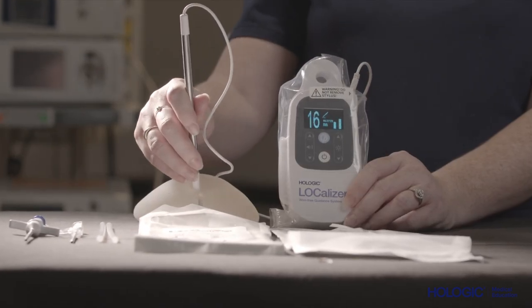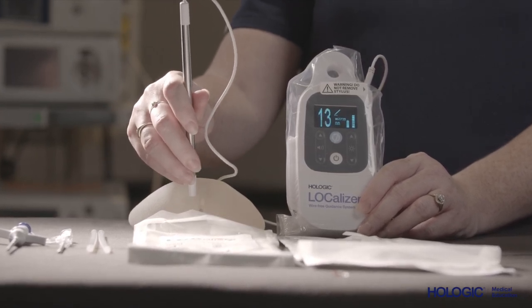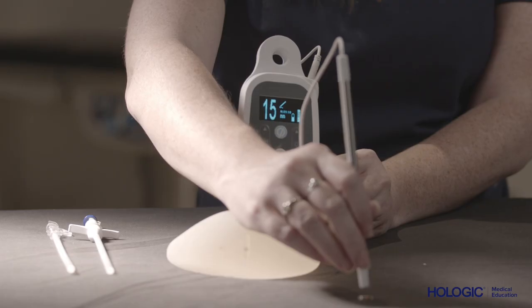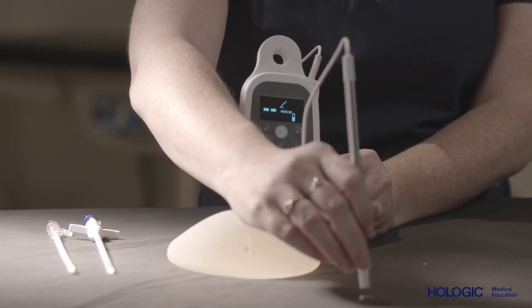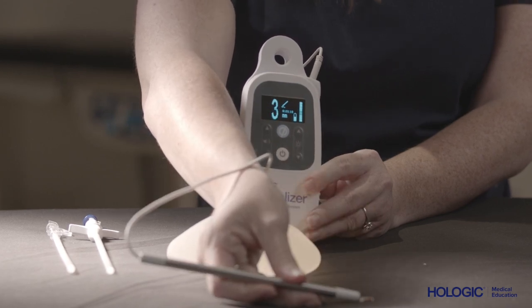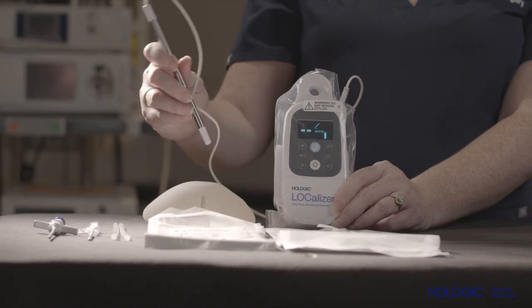The second probe is a surgical pencil probe, which guides the surgeon to the target tissue during the procedure while dissecting down into the tissue. With both detection probes, the reader displays the distance from the tag in millimeters. The lower the distance measurement, the closer you are to the tag. The tag's unique identification number is also displayed on the screen.